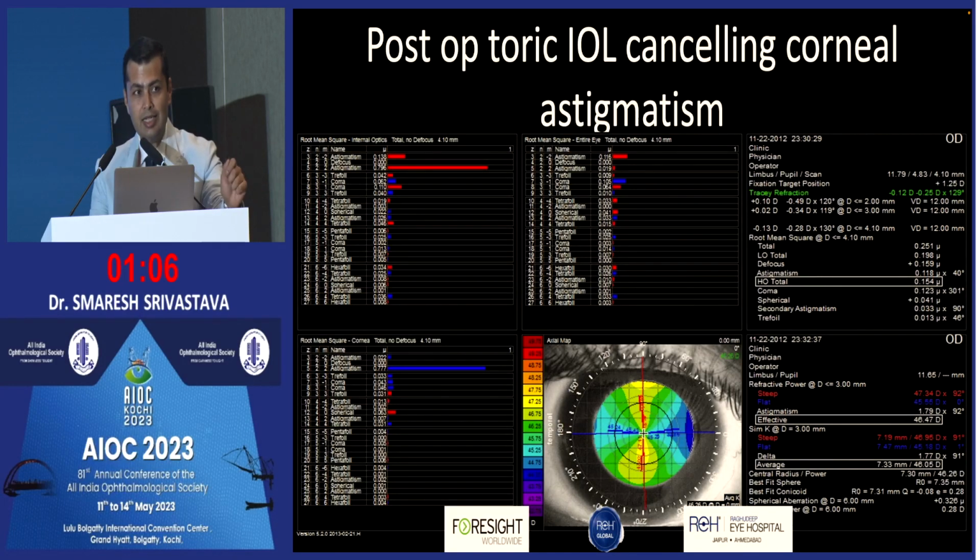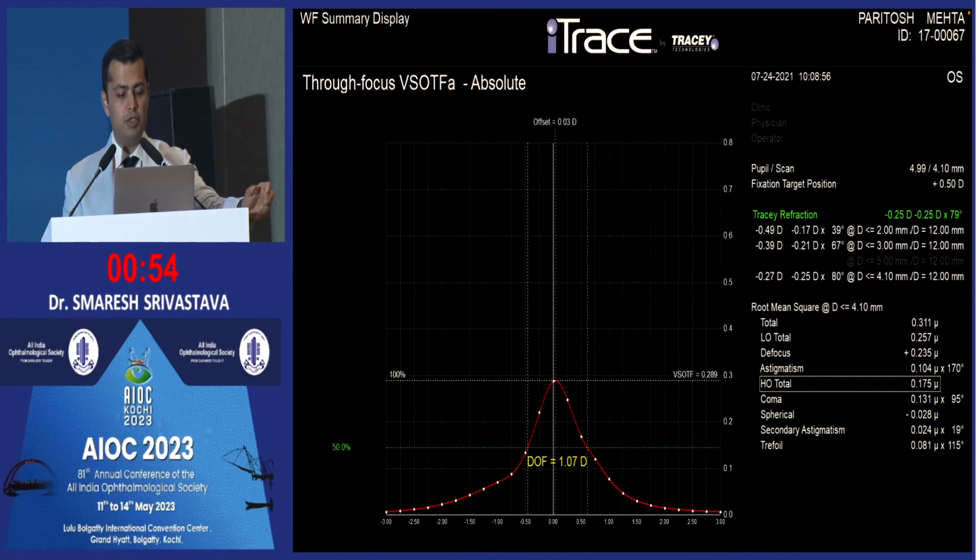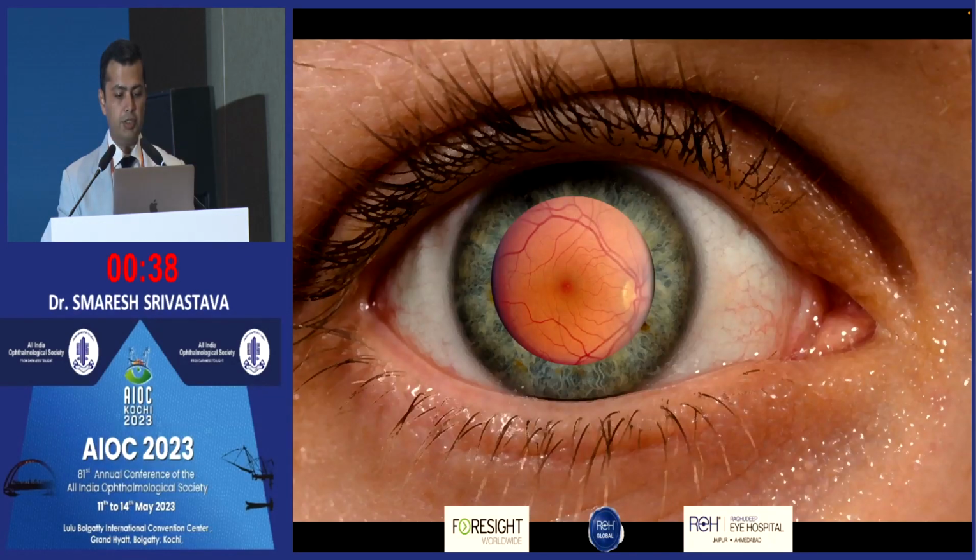So like I said, indulgence, because unhappy patients are few and far between. But when they're there, rather than shunning these off, it's best to at least get these tests done because you will know what the culprit is and you will be able to target a treatment approach. Sometimes, it's very, very interesting. Now this machine, the new aberrometers can also span out your depth of focus or what is your range of vision, even for pseudophakes, but also for phakic patients. So if you're planning refractive surgeries, you can see what is the depth of accommodation.